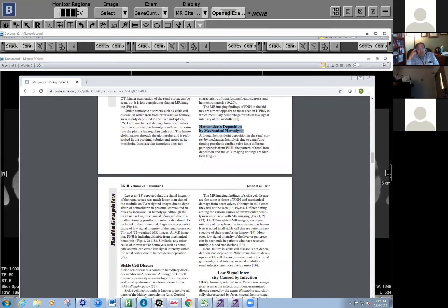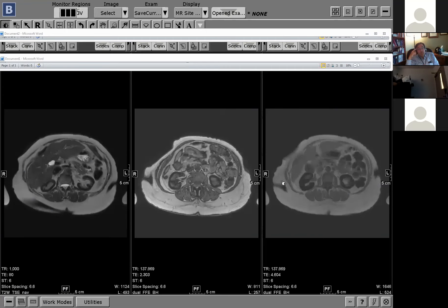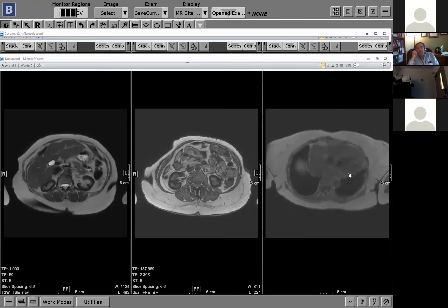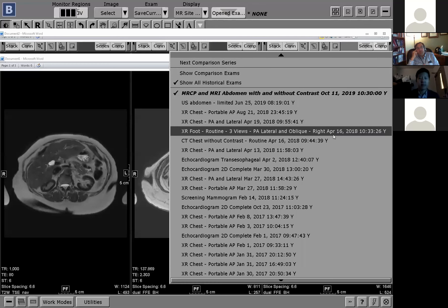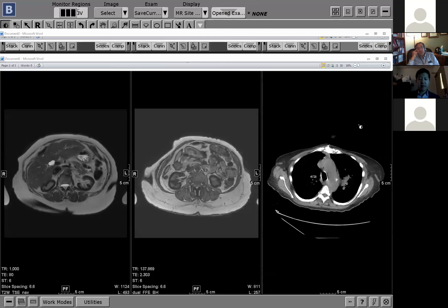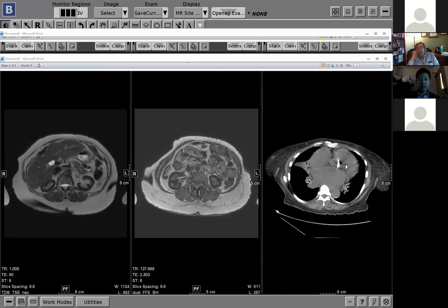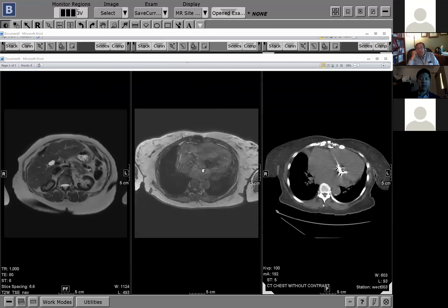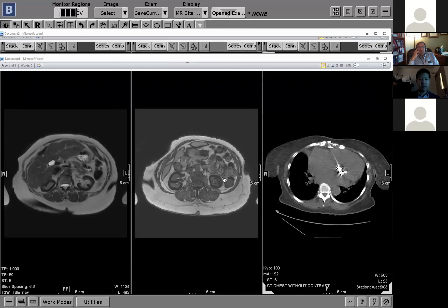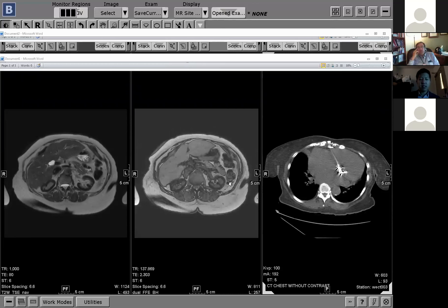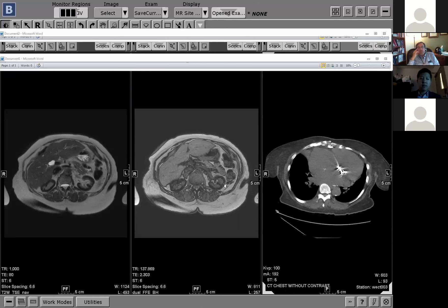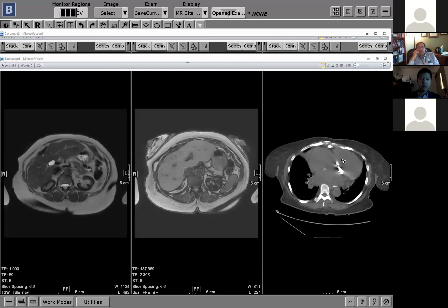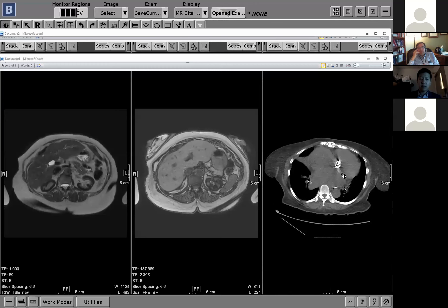When we looked, this patient does have an old mechanical valve — we found a CT and could see the mechanical valves. That's what I believe is the cause, because the patient has no history of anything suggesting PNH in their chart. So we read this out as cortical hemosiderin deposition related to hemolysis secondary to mechanical heart valves.